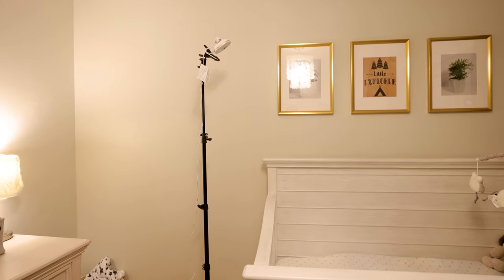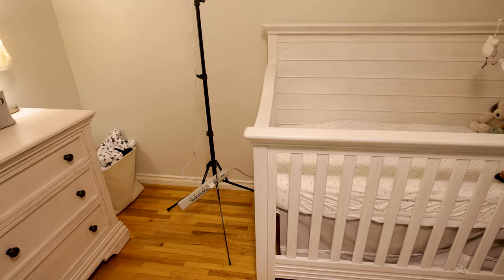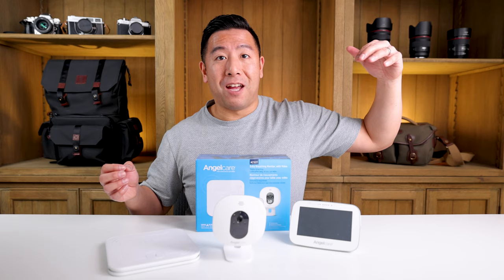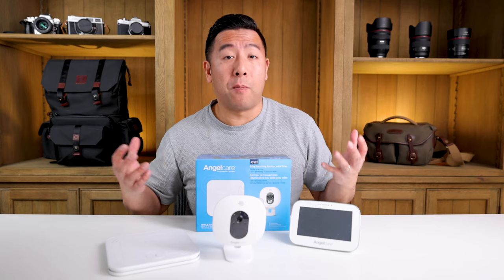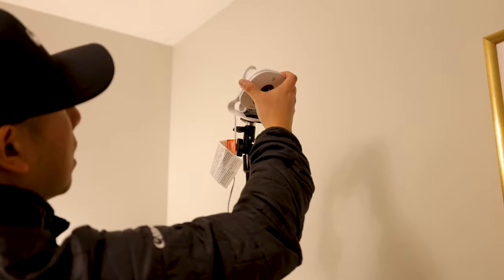I had to MacGyver my own solution to mount it onto a light stand and position it above the crib so I could see my baby, and so that it was tall enough for my wife and me to pause and unpause the camera.